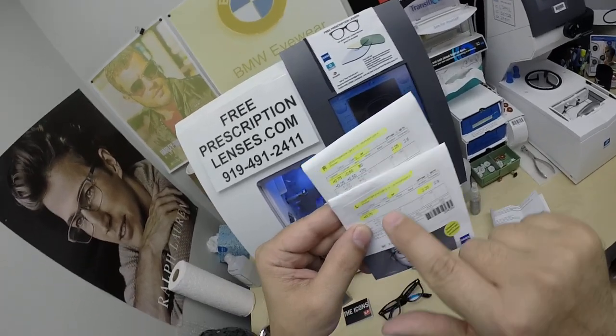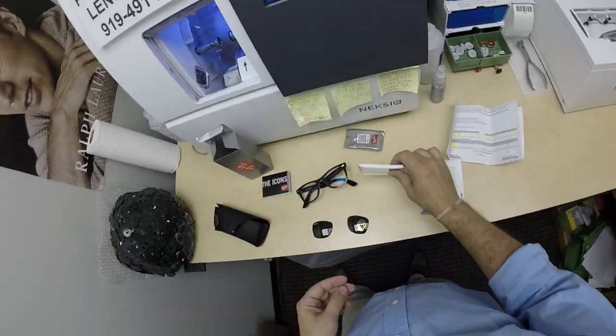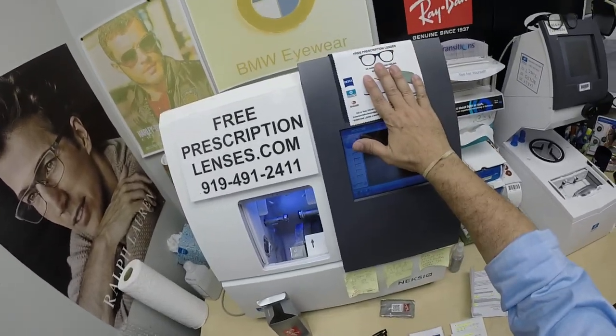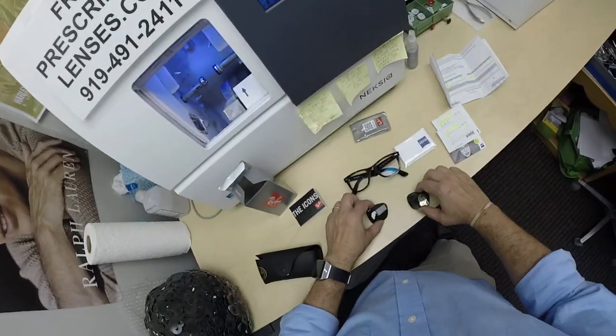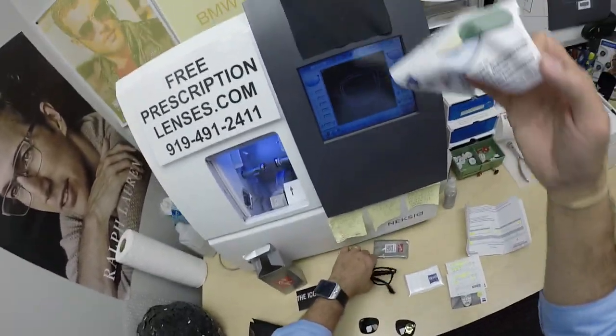You're going to get the Zeiss Cleaning Cloth and one of my premium microfiber cloths. Let's go ahead and activate this just to see how close this is to the original G15 — and it is very close.